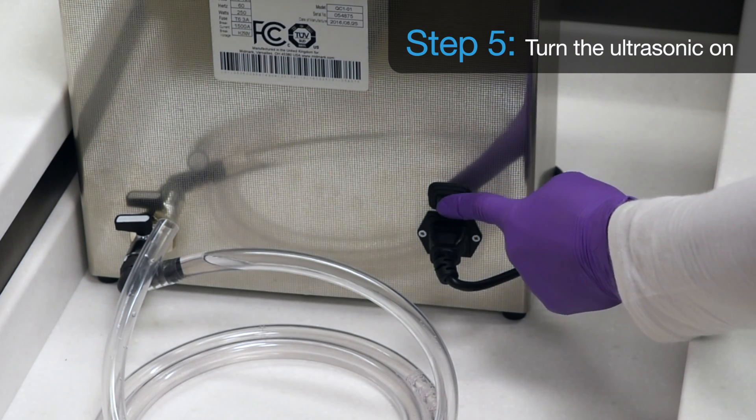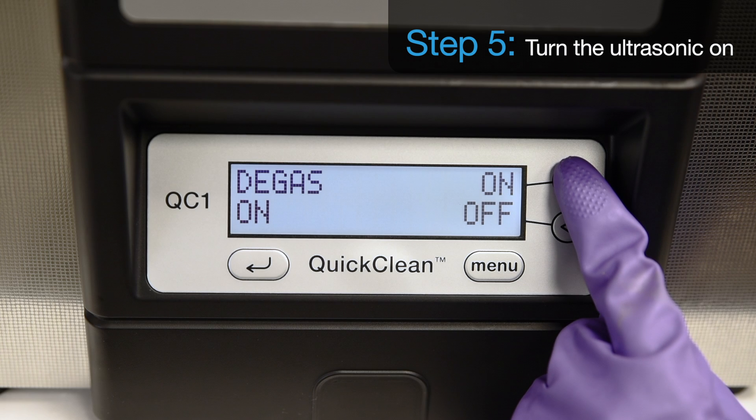Step 5. Turn the ultrasonic on and run the degas cycle for 10 minutes to degas the solution.